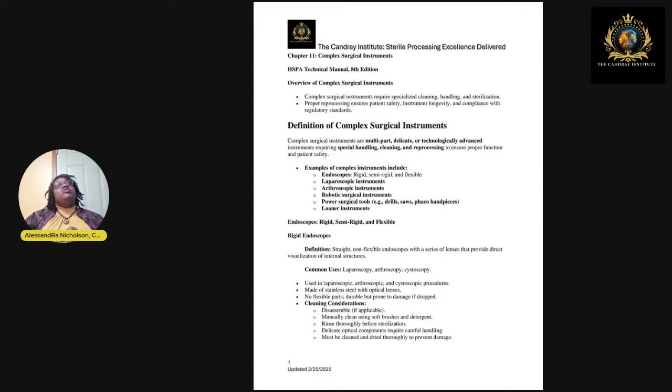For instance, on top of your set to fix a knee, you might have to have a set that allows me to build a new kneecap. That's not instrumentation that I may have in my facility. This manufacturer may have it, but that set of instrumentation may be 15 different trays that allows the surgeon to put that thing together, right? So it becomes its own beast.